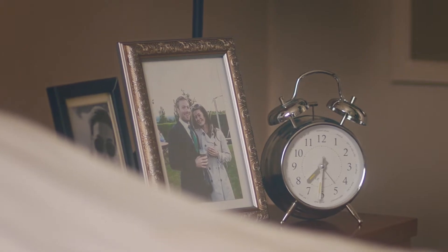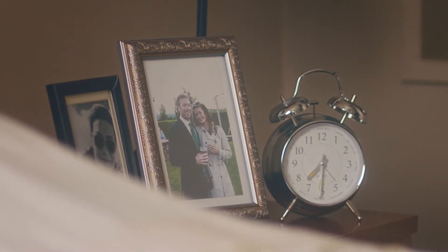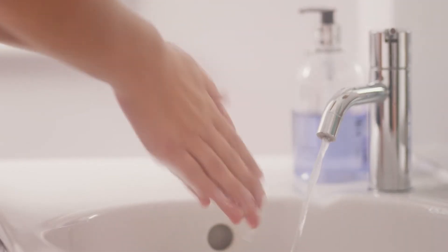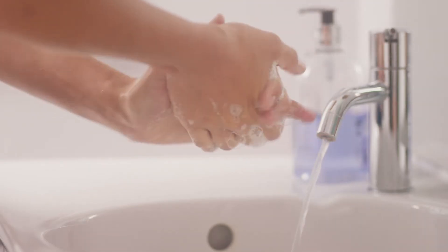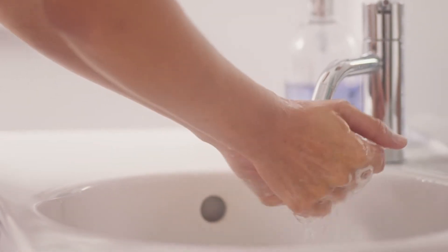Hi, that's me Rachel in the picture there, with my husband Tom. We've been trying for a baby for a little while now, but recently we decided to try IVF. Like you, I've just been prescribed Gonal F. Today, I want to show you how to inject yourself using the Gonal F pre-filled pen. You'll see that it can be quite easy.